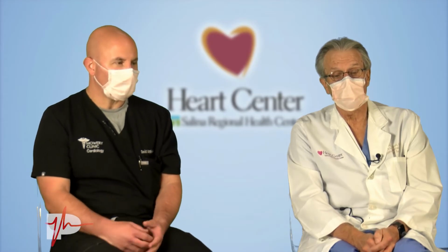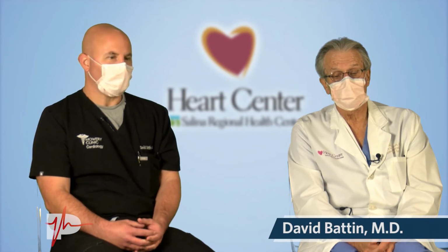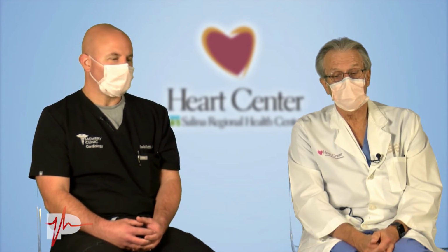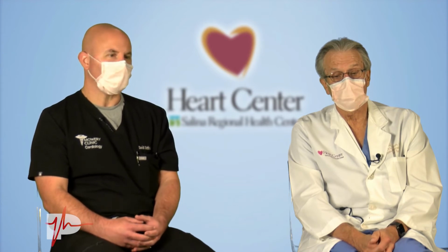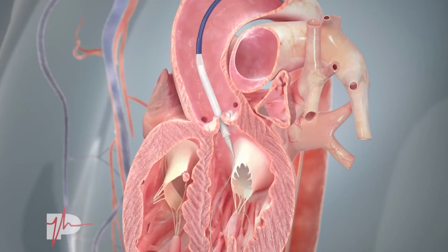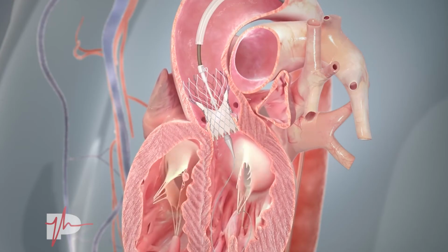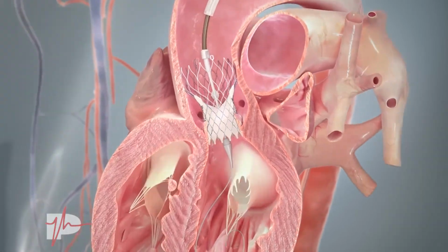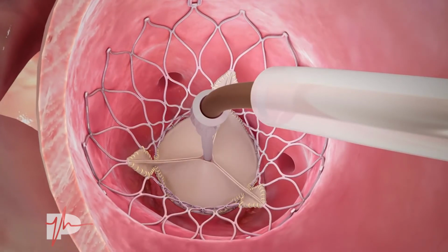And so what is the procedure? How is it done in the heart then? So the TAVR, as we've been referring to, is a transcatheter aortic valve replacement. We're able to take the valve, and now this meticulously hand-sewn and handcrafted valve is crimped down or compressed and placed into a delivery system that we then take over a wire to the heart at the level of the aortic valve, and instead of obviously taking that out, we're just pushing it out of the way. And that's it in a nutshell.